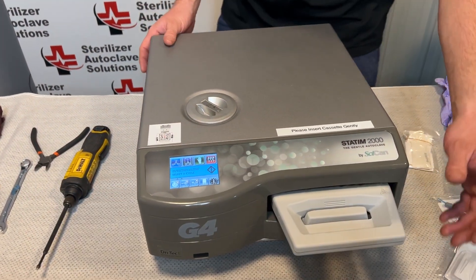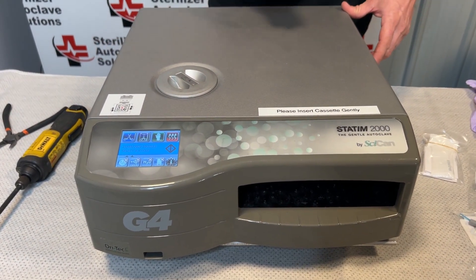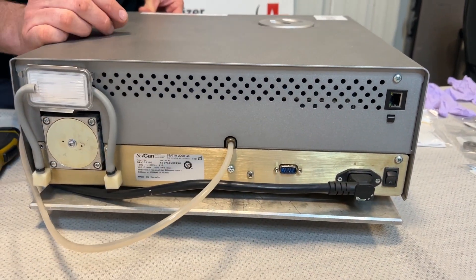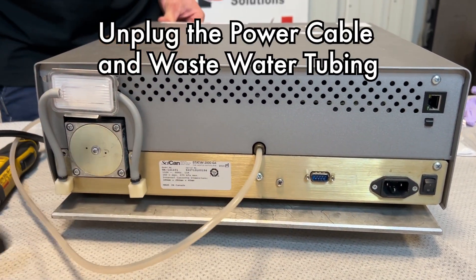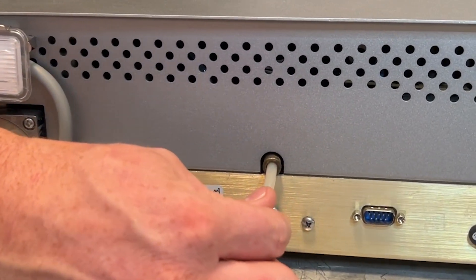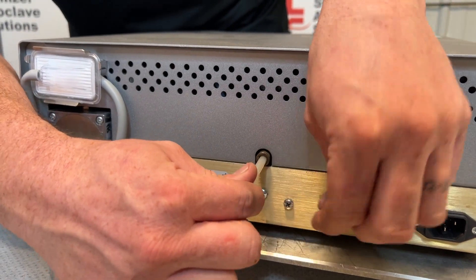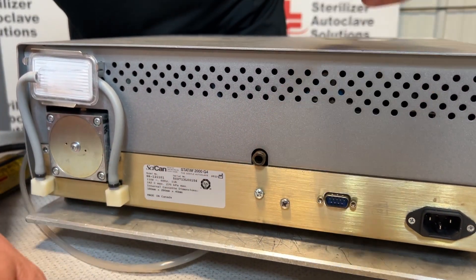First thing we're going to do is remove our cassette and set that off to the side. You're going to want to have access all the way around this unit. Next, come to the back and turn it off with the rocker switch. Unplug the unit and remove the waste tube. To remove the waste tube, push in on the tube, hold that slip ring in place, and the tube will pull out.